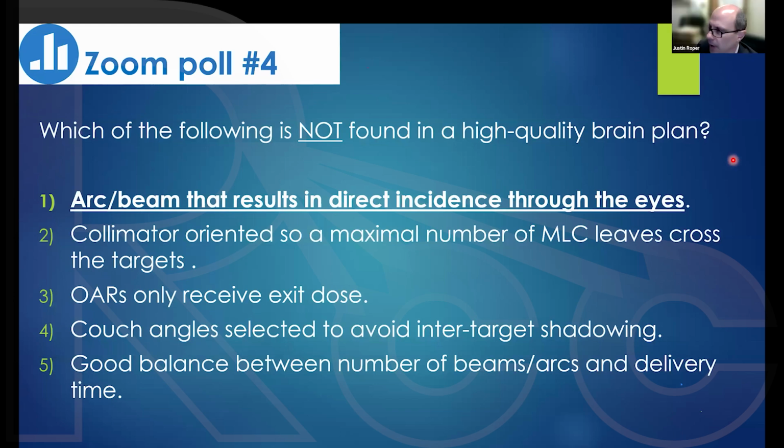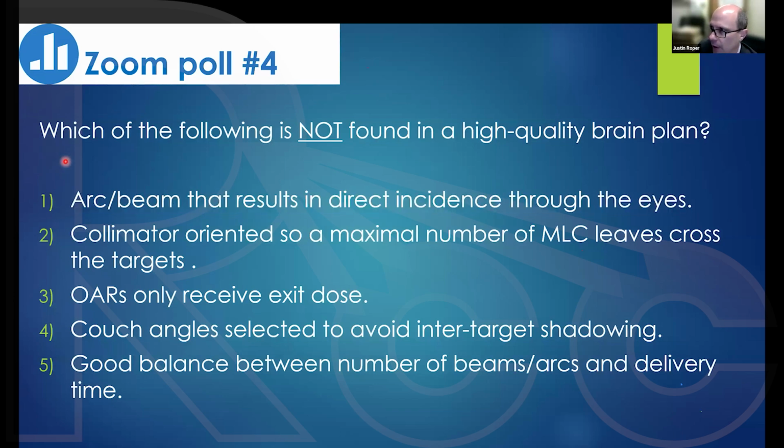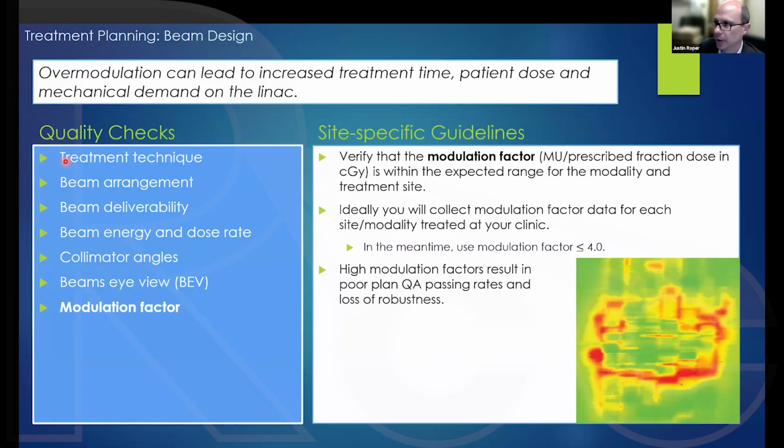Jose, there's a question in the chat which is related to the modulation factor. Could you briefly repeat how that modulation factor is determined?